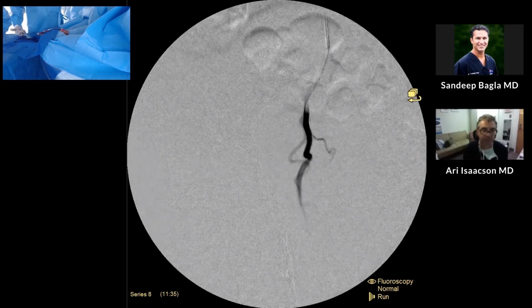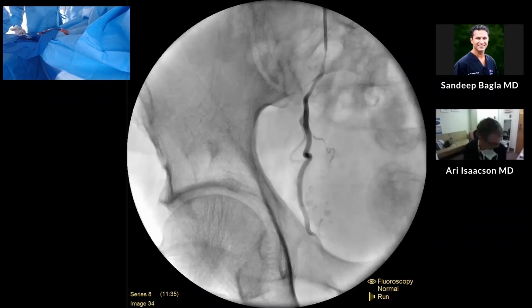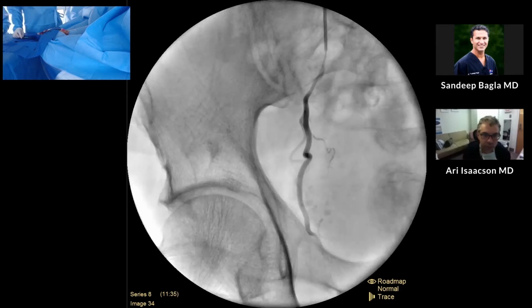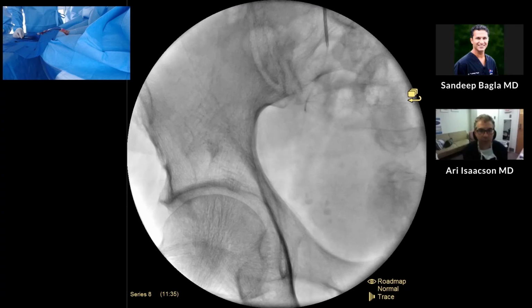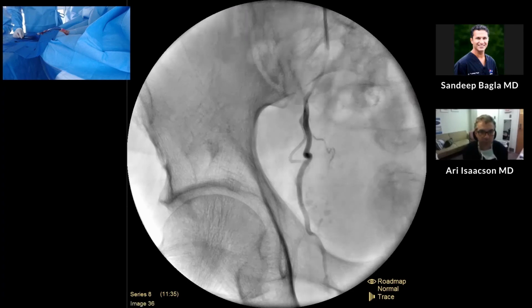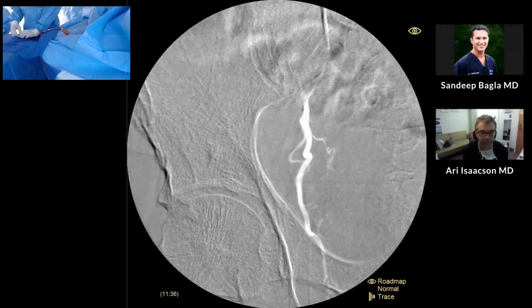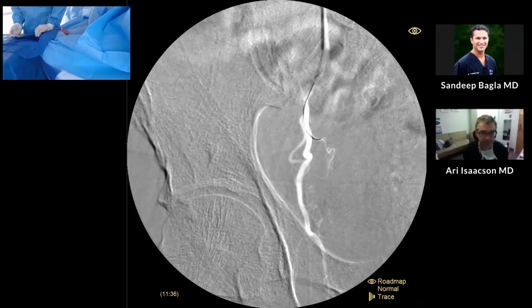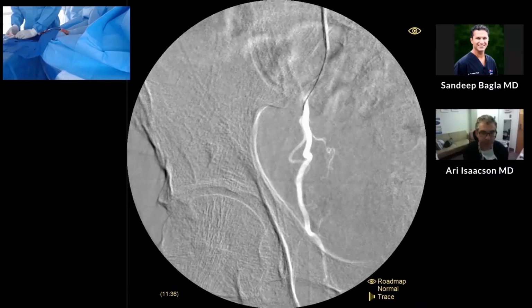So I think using the ability to inject and do imaging through the microcatheter, honestly, is really important. Something that I think is maybe not as often talked about or discussed is really how can you get good imaging through the microcatheter and then make your decision rather than just fishing around and repeating your run or your base catheter in so many different angles. Right. I think that can be very frustrating, especially if you want to have a lot of throughput, and you want to be able to do a certain number of cases and not struggle all day. Not to say that we won't struggle with this.